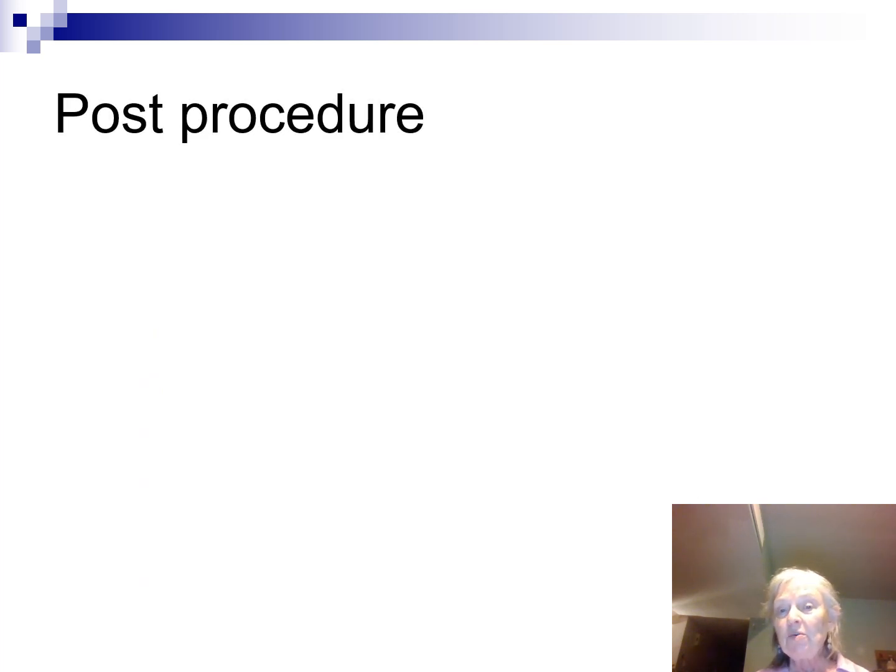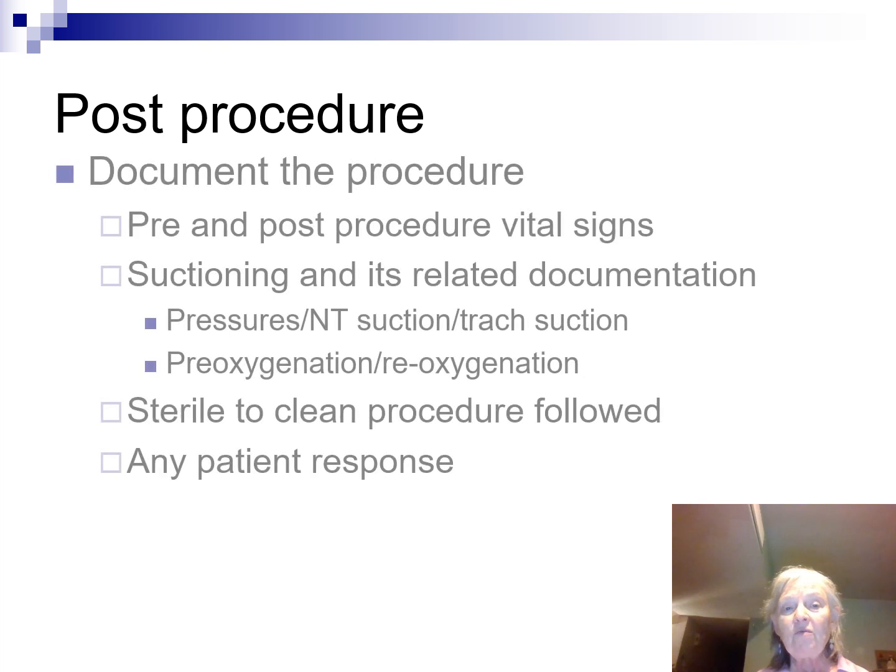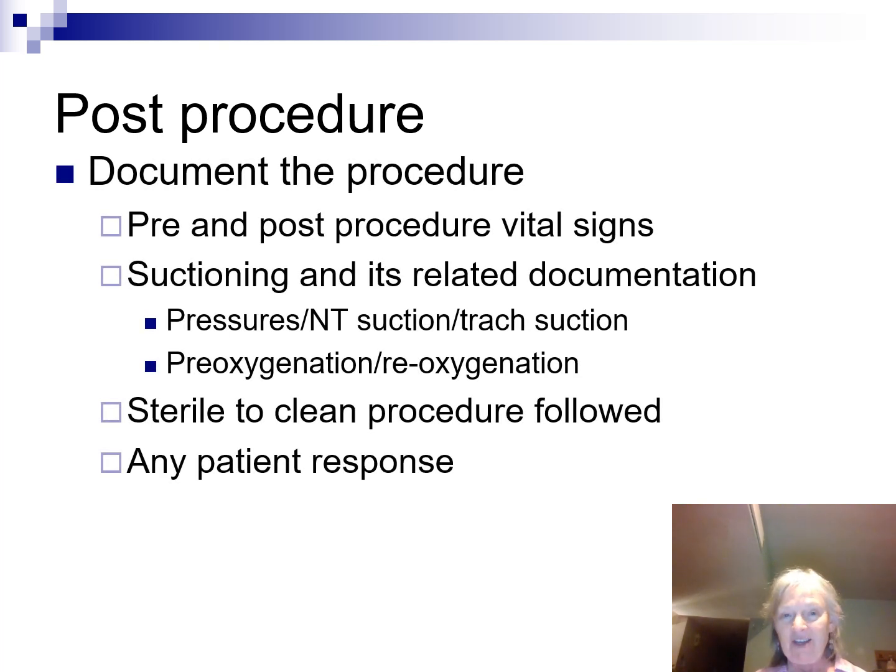So now you've finished with the procedure, you got everything working for you, it's time to document. You're going to document both your pre and post procedure vital signs. You're going to make sure your vital signs are still within the steady range or better when you're finished. If you suctioned, you're going to do all your documentation for your suctioning at this particular point. The pressures, what happened to them, how did you take care of it, did you pre-oxygenate, did the sats stay good, all of that we talked about with suctioning.